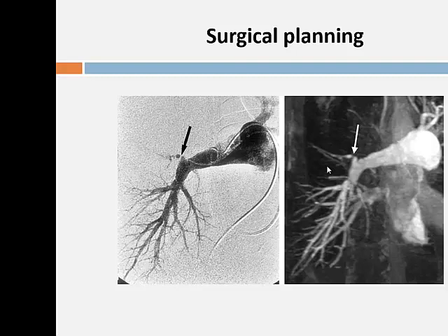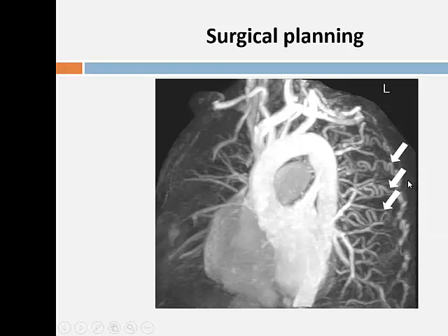Normally, to acquire a volume of data on MR, thinking about your coronaries, if you do coronary MRA, that will take up to 15, 20, 25 minutes to acquire. Nobody's going to hold their breath for that long, so you have to use this navigator method to track breathing to acquire your data at a particular breathing point. With gadolinium, because it causes such marked T1 shortening, you can build on that and use that to give you the contrast to noise resolution that you wouldn't normally have. So that's why you can acquire a volume, and that allows you to do all the reconstructions. Okay, so you can also see collaterals in the same way as you would on CT. So here's loads of intercostal collaterals.